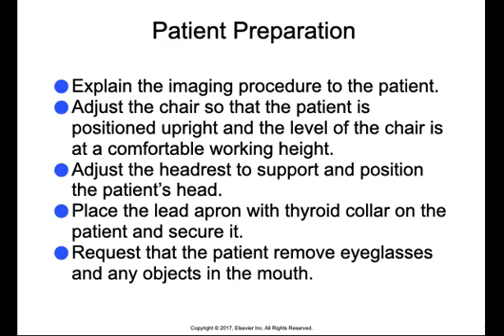You want to place and secure the lead apron with the thyroid collar on the patient and request that your patient remove eyeglasses and any objects in the mouth, such as dentures or retainers or chewing gum that may interfere with the procedure.